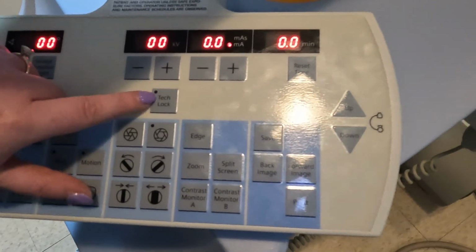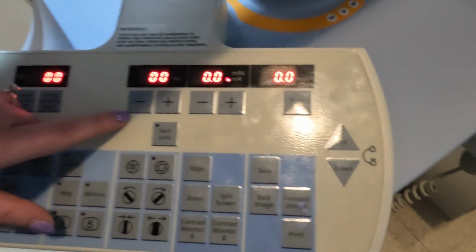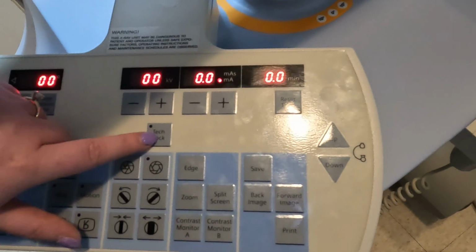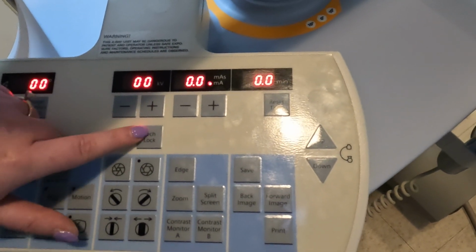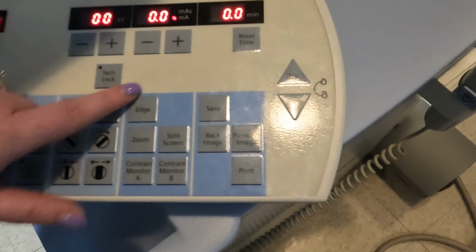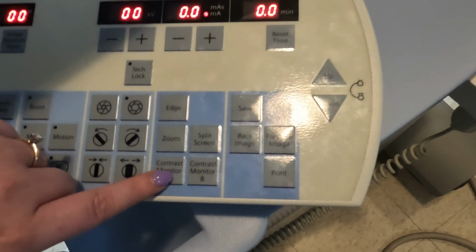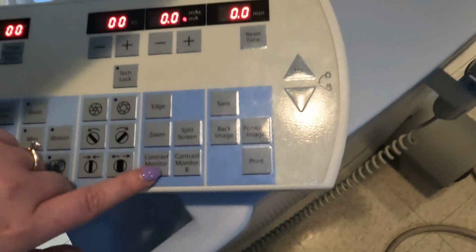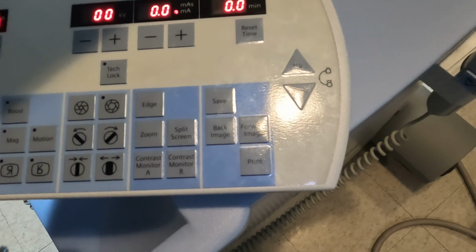Up here is your technique lock. So if you're using a technique that you really like and it's working very well and you don't want the AEC to change it, you would just click this button here and this will never change. It'll stay where you put it. This is kind of used for your subtraction. We don't use this very much, but if for some reason you need to change the contrast quickly on your image that's on the screen, if you click this button, it'll change your first screen. If you click this button, it'll change your second screen.